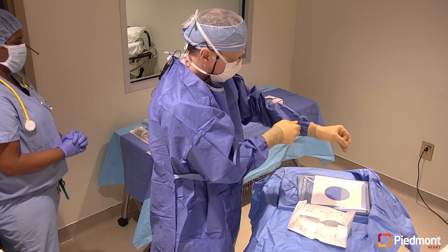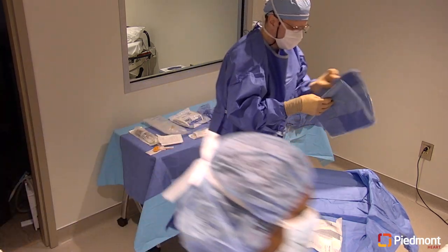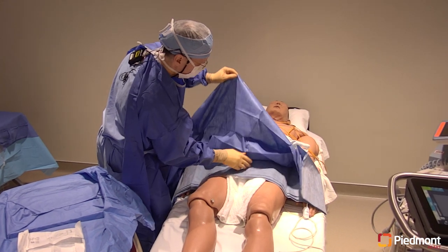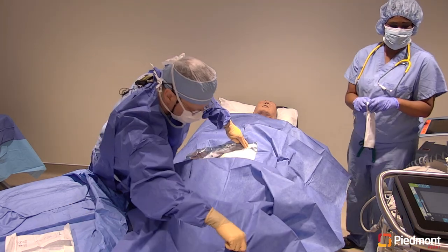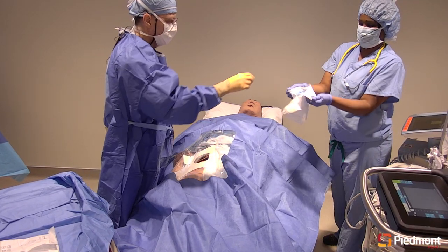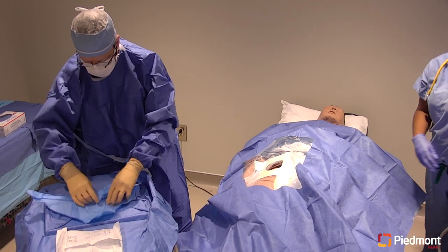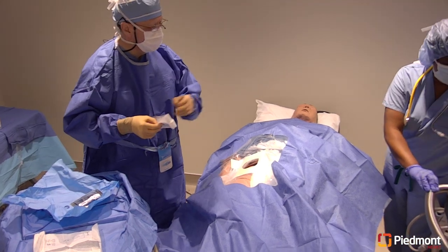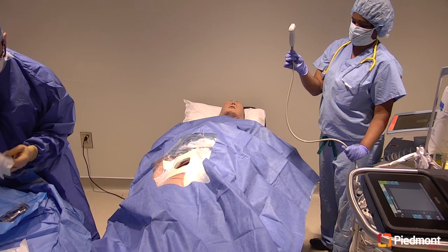Be prepared to assist the provider in placing the probe cover on the ultrasound probe in a sterile fashion. I'm just going to put this drape on, Mr. Smith. Okay, probe cover. Thank you. Notice Nancy did not touch the contents of the probe cover package. The smaller probe, Dr. Barrett? No, that one, dear. Thank you. Notice she is remaining free of touching the sterile field.